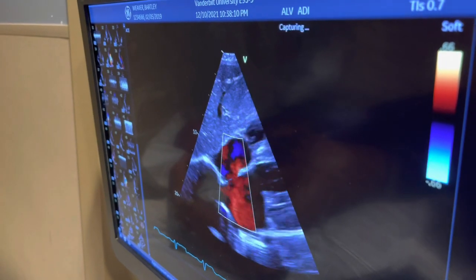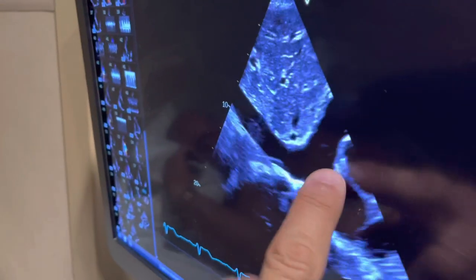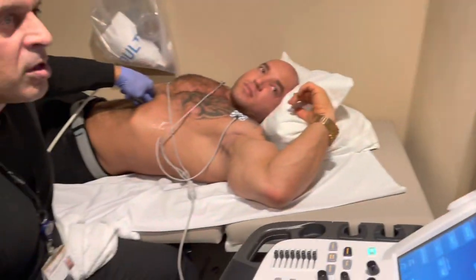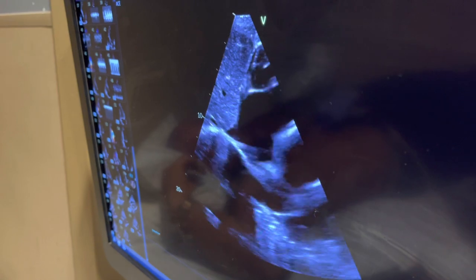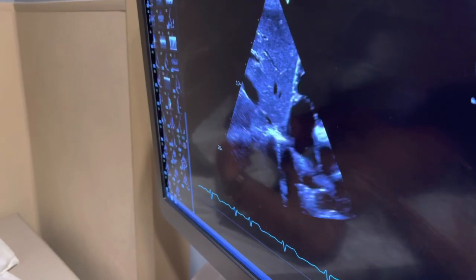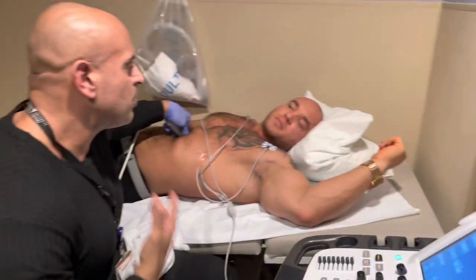We're going to make sure there's no abnormal flows. This blood vessel brings the blood back from the lower body to the heart. Now do this long sniff with your nose — and breathe. See how it collapses? And when you breathe it opens back up. That's good — it shows normal pressures. If blood were backing up to your legs — what we call edema — that vessel would not collapse. It's called a sniff test. Veins collapse when you breathe in, and that's how they bring blood back to the heart.